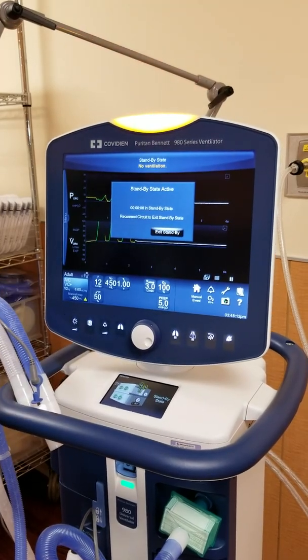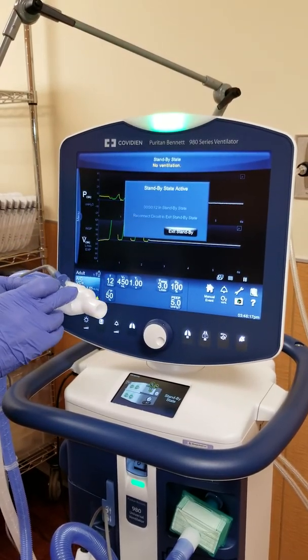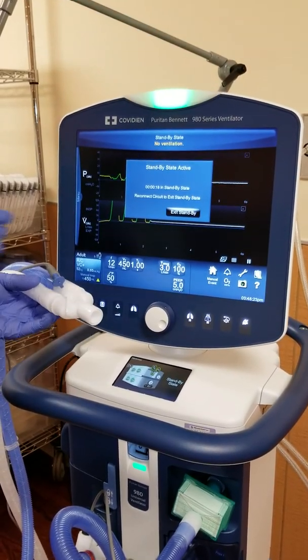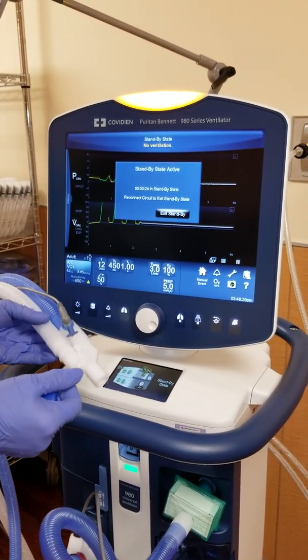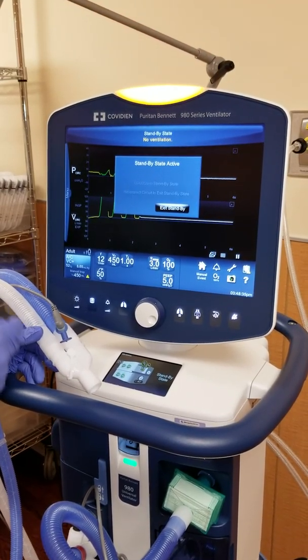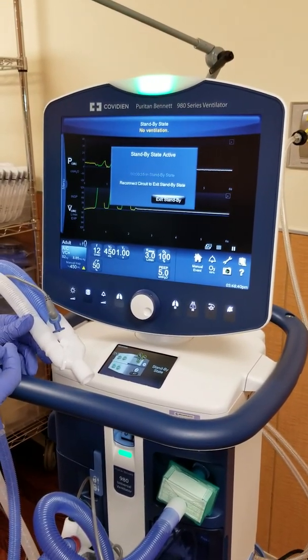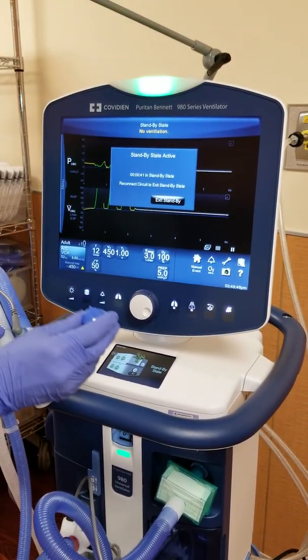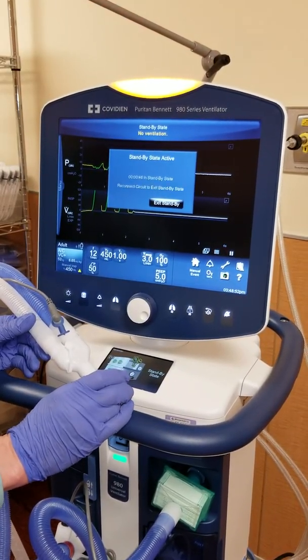Now, there's only one last thing to know about this machine. We are used to putting caps on the circuits with our Avias. This machine is constantly blowing air through here, so it'll never allow a microorganism to get into the circuit. If you cap this, it's going to think it's on a patient, and it's going to try to ventilate, and it will come out of standby and alarm and then go into a safety mode. So the biggest quirk with this new machine, this Puritan Bennett 980, is that the only time we'll put the caps on them is if it is completely shut off.